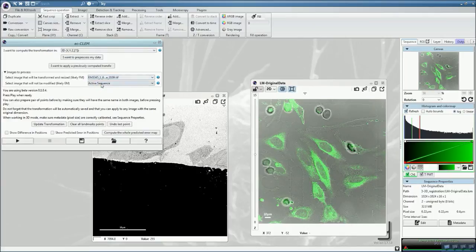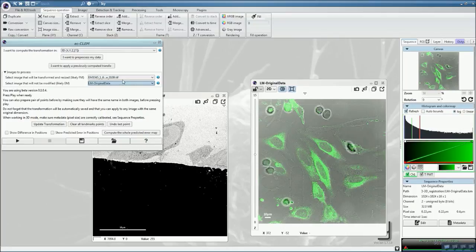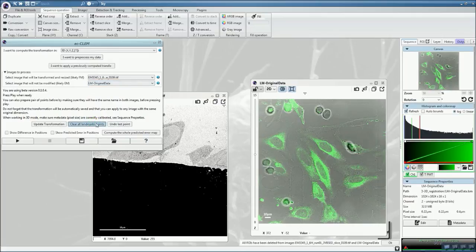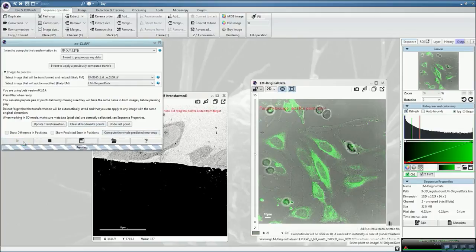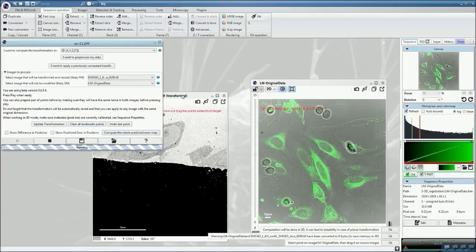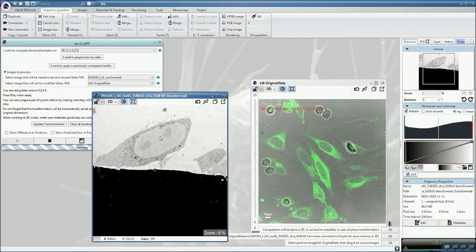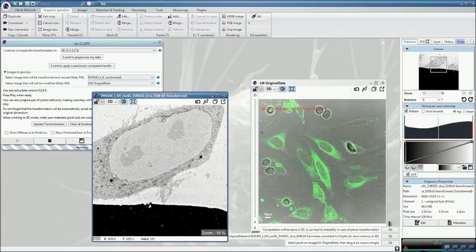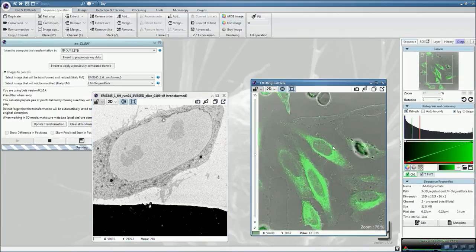Then we want to register the electron micrograph into the light micrograph. So in this case, we inverse the source and the target. It's not going to be fluorescence microscopy here, but electron microscopy. Then clear all the landmark points that could eventually be placed beforehand, and start the plugin.